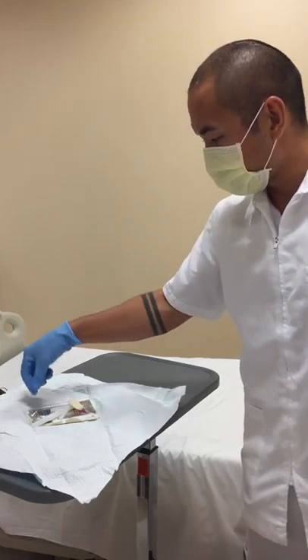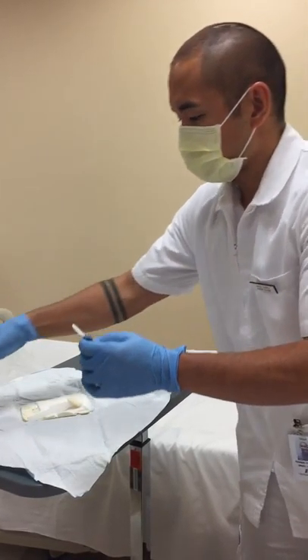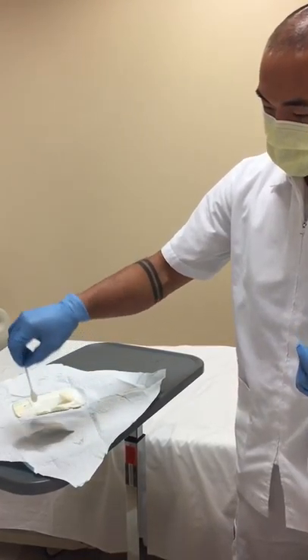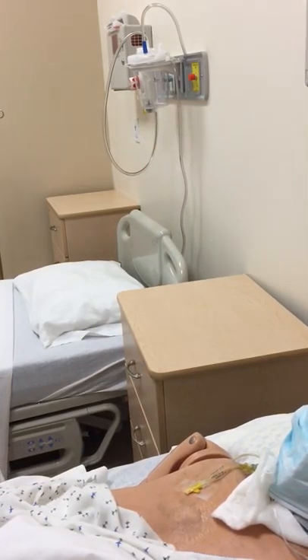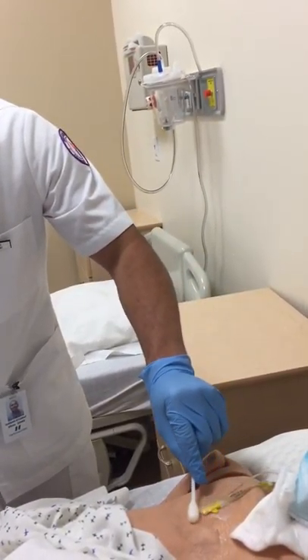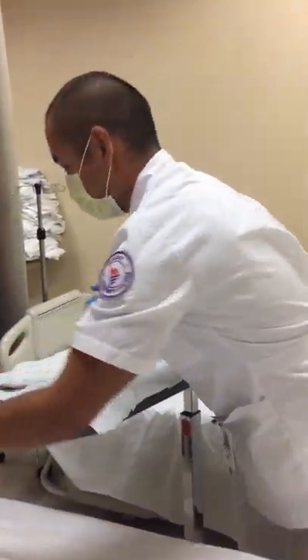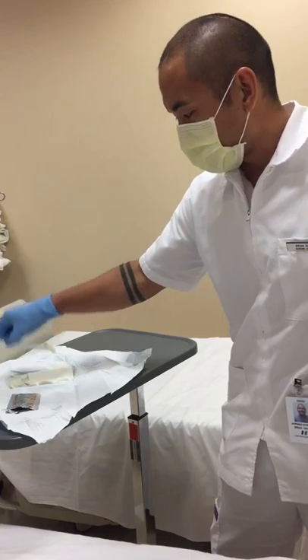I'm going to go ahead and clean the wound using the alcohol swabs. I want to make sure I'm designating a clean hand and a dirty hand — my left will be the dirty hand and my right the clean hand. I'll pull out the swab, transfer it to the dirty hand, and clean always from in to out. Clean hand to dirty hand — then toss. I want to make sure I use my clean hand and let that dry. It doesn't have to dry right away because I'm going to clean it with the chloroprep.